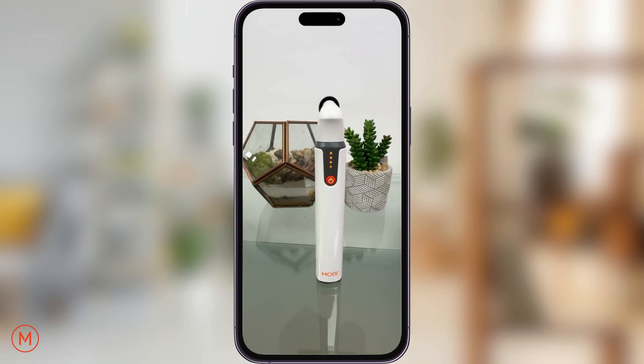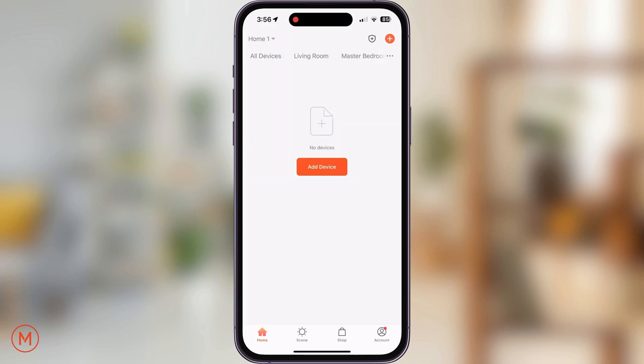After doing so, please press and hold the Autoscope's power button until the four lights begin flashing. On the main screen of the app, tap on the orange button with the white plus sign and tap on scan.